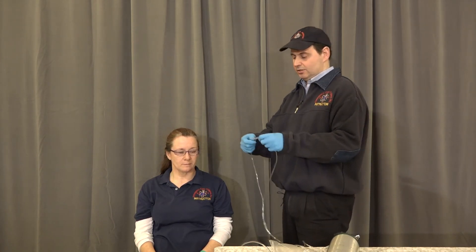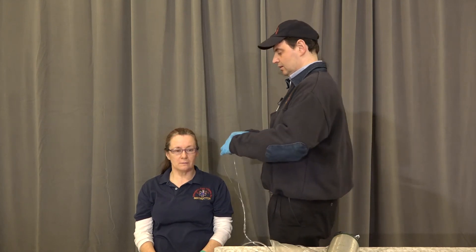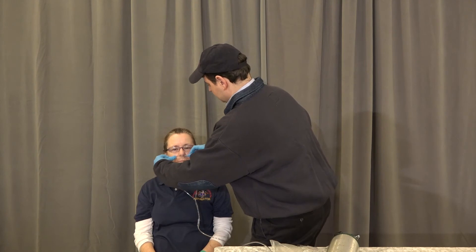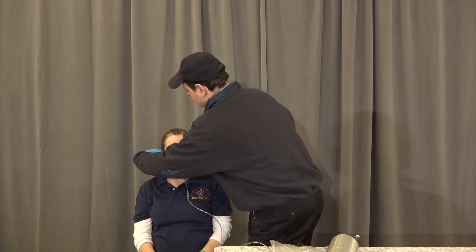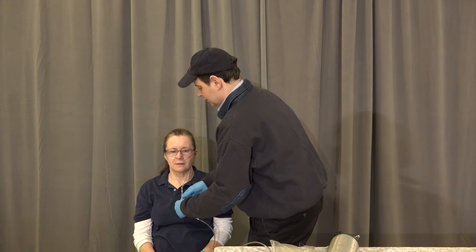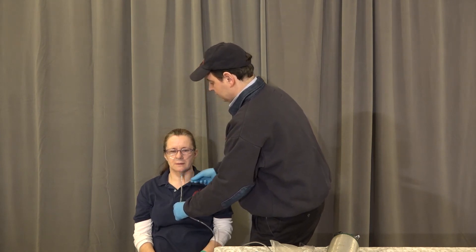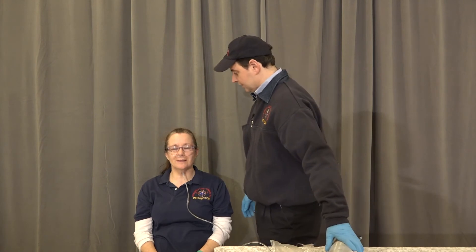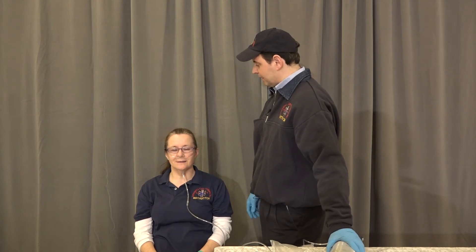Set the flow meter to six, place it into her nose, around her ears, cinch it up under her chin. 'How does that feel for you, ma'am?' 'Much better.' Okay, just breathe as regularly as possible, please.